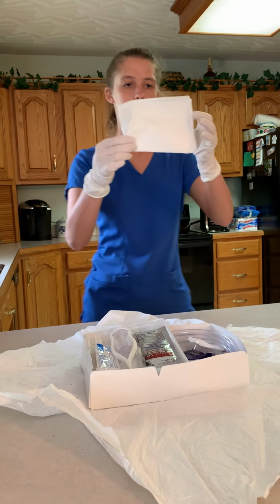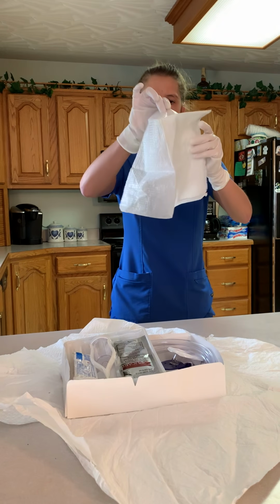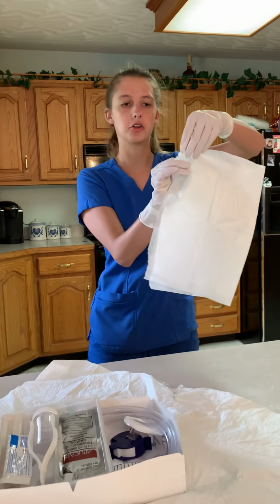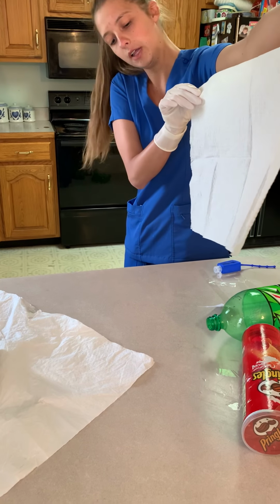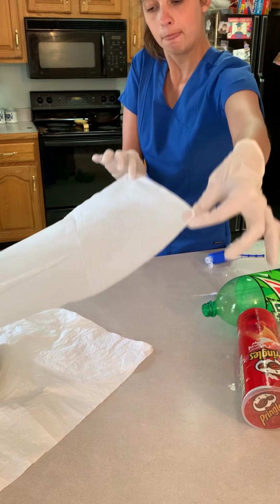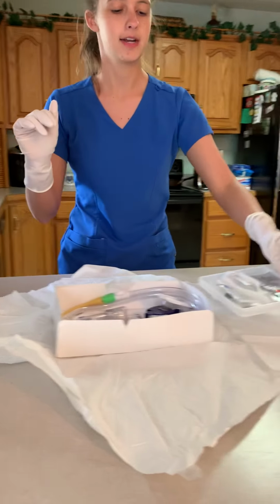And I'm now going to open up my drape. Again, I'm not going to cross over my sterile field. And I'm going to make sure that I leave the shiny side down. And we're not going to cross over our sterile field. Not going to let the drape touch me, and I'm not going to let the drape touch the patient. So we're going to go ahead and let go. Okay, so I have my drape ready to go. Now I'm just going to get my tray and set that down.